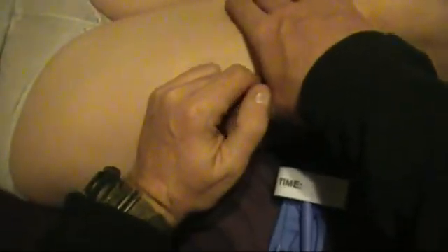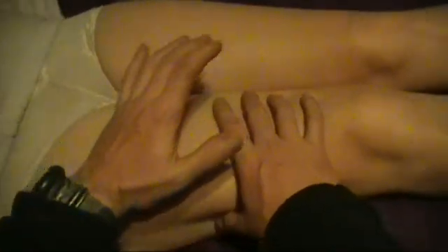Ta-da! Okay, so first thing I'm going to do is apply pressure to the wound. Now, you can also utilize different pressure points where the artery runs close to the bone to stop it. In this location, that's probably not going to happen. There's a lot of musculature in the thigh that you're going to have to get through to get to that. So, I'm kneeling on my patient. I'm blocking the hole.